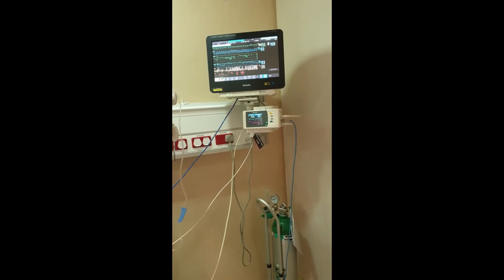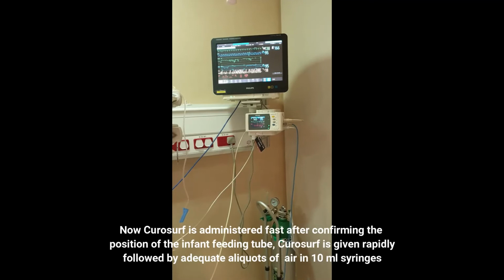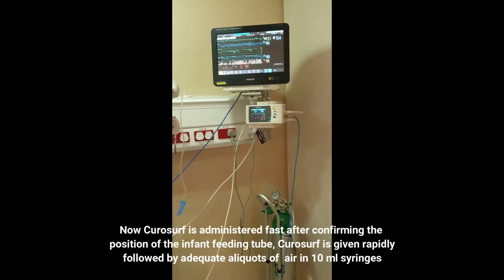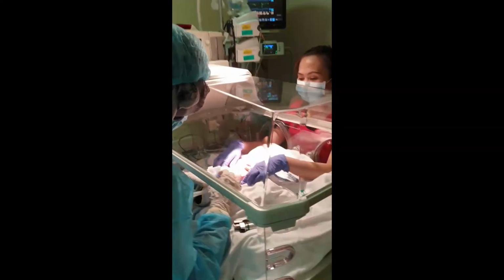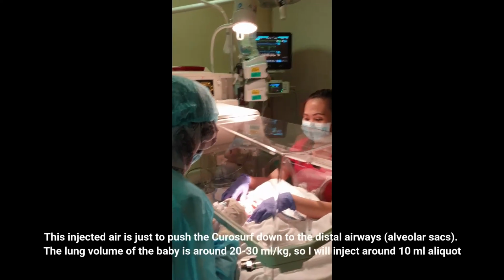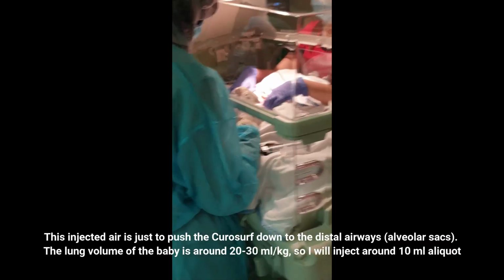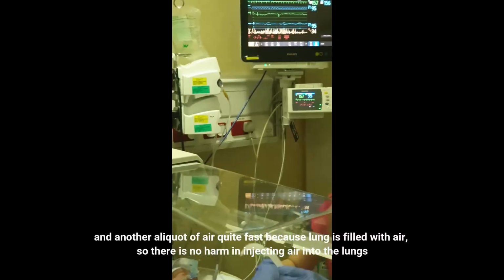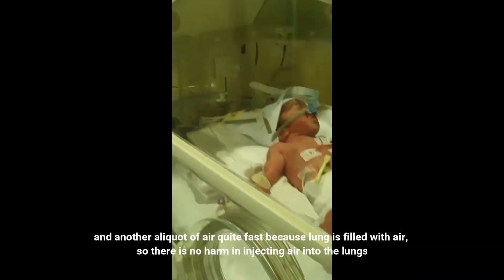Now, Curosurf is administered fast after confirming the position of the infant feeding tube, as you would administer through an endotracheal tube. Curosurf is given rapidly, followed by adequate aliquots of air in 10 ml syringes. This air injection is just to push the Curosurf down to the distal airways, the alveolar sacs. The lung volume of the baby is around 20 to 30 ml per kilo, so I will inject around a 10 ml aliquot and another aliquot of air quite fast, because the lung is filled with air and there is no harm in injecting air into the lungs.